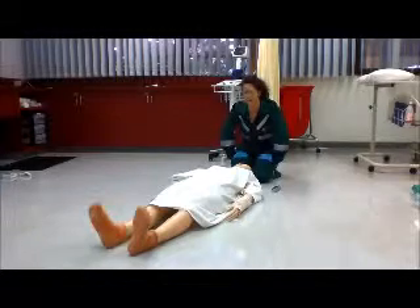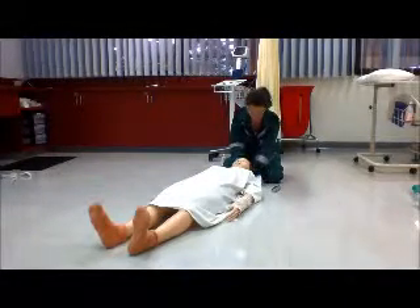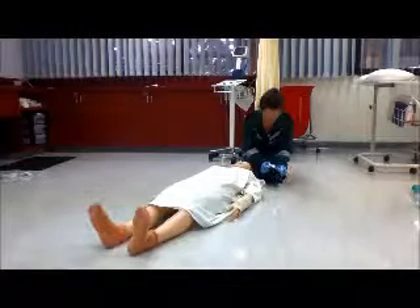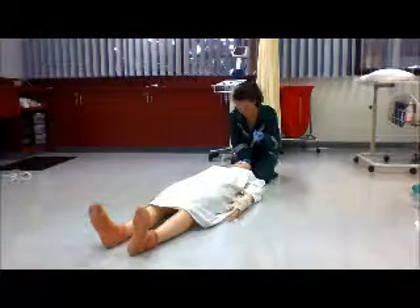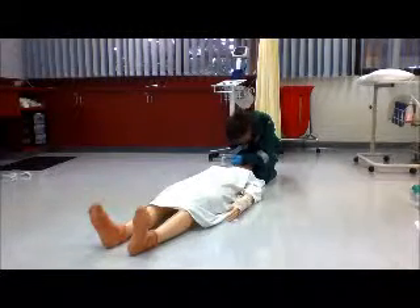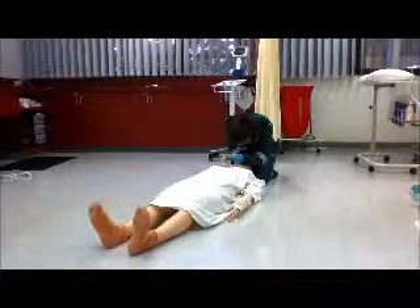I will now demonstrate how to perform a laryngoscopy to inspect the patient's upper airway. First you need to support the patient's head with something soft like a towel or a pillow, and put their head into the sniffing position. Then you need to check that the bulb is working and well attached to the laryngoscope. Hold the patient's head steady with one hand on the forehead, then put the laryngoscope down the right side of the patient's mouth and sweep the tongue out of the way. Slide the laryngoscope into the vallecula groove to inspect the vocal cords and see if there are any obstructions.